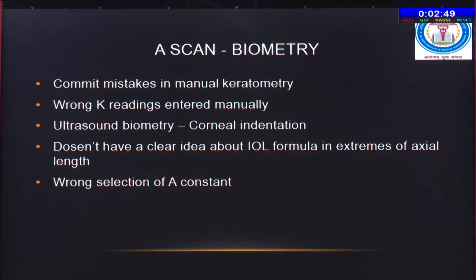Currently the optical biometry is the gold standard, and now we are moving on to the OCT based biometers. But still there are many centers in India, especially the government setups, or, more to add to the condition, the private medical colleges, that still rely on ultrasound biometry, the immersion type and the contact type. So in such situations, the A scan keratometry has to be done manually. And the common mistake committed by the resident is taking the manual K readings. Even if they take them correctly, there is at times difficulty in entering them correctly into the biometer machine. So that is a difficult part, and that has to be taken care of.